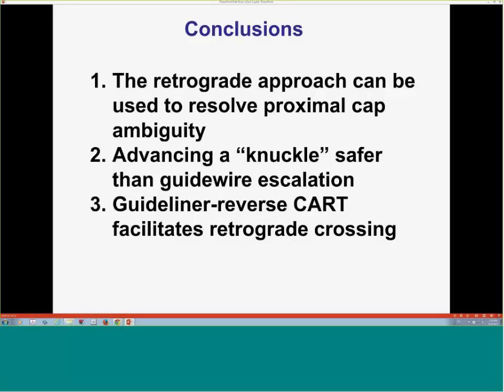This is great. So again, another interesting thing to get people's thoughts on, we're just looking at periprocedural MI with dissection re-entry versus retrograde versus antegrade. And I don't know if anyone has any data or if people check their enzymes, but the preliminary data we have is a CK-MB 3 times the upper limit of normal in about 6% for regular antegrade, 11% for dissection re-entry, and 35 to 40% for retrograde.